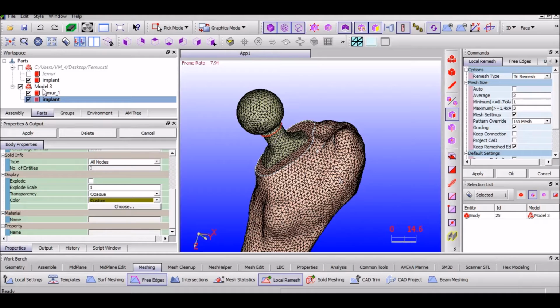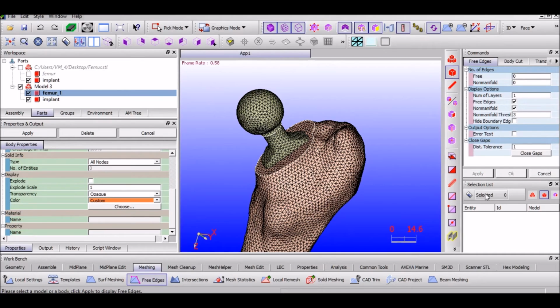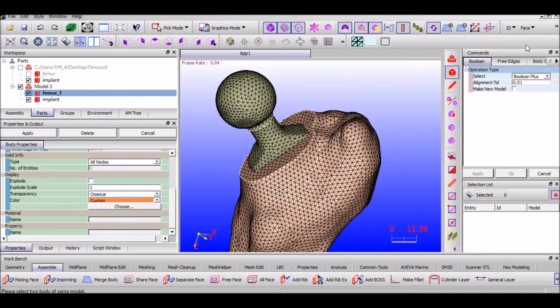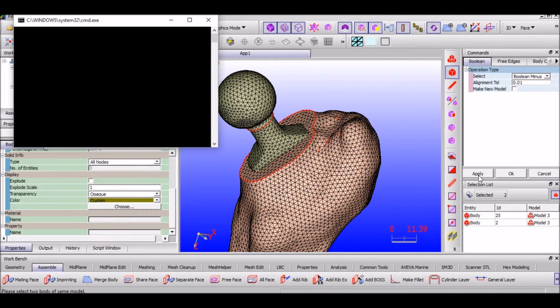Now that one body has been remeshed, remesh the next body. As you can see, both the bodies have been remeshed. The next step is to create a cavity in the femur where the implant is fitted. Hence, select Boolean minus, select the femur first and then the implant, and then click apply.